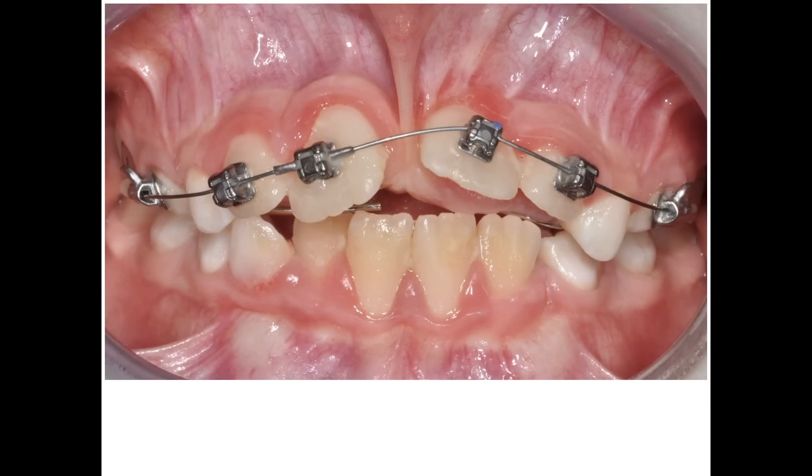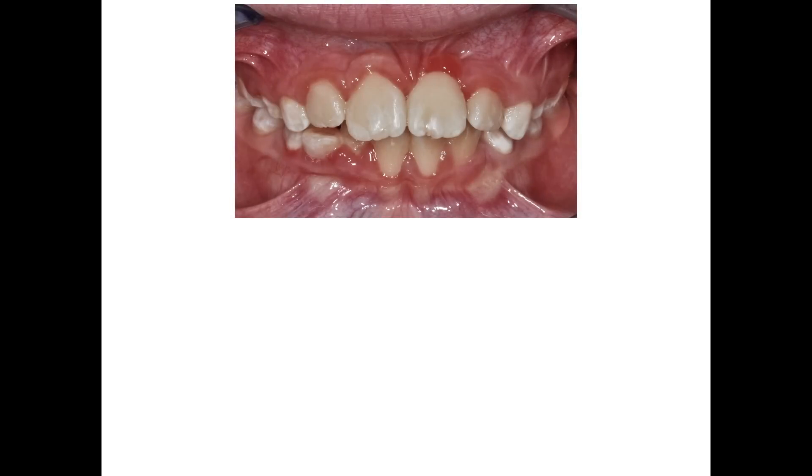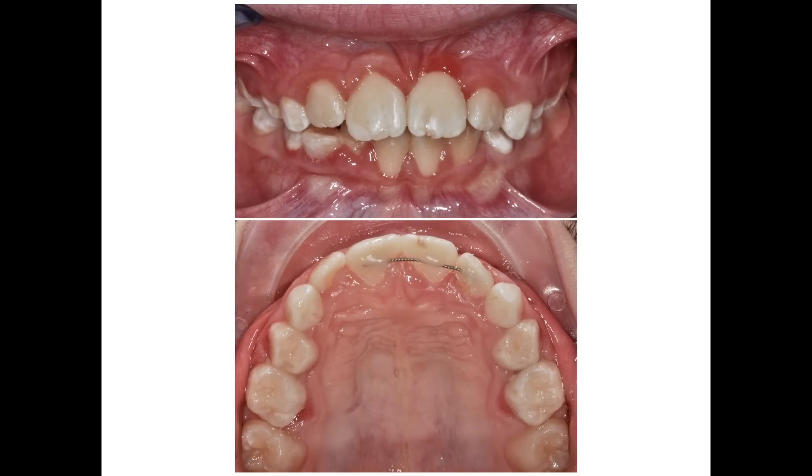As you can see, the teeth are moving towards the right position without major inconveniences, aside from some gingival inflammation. After six months of interceptive treatment, 21 is in the right position. The poor oral health of the patient did not help the newly formed gingiva to look great, but hopefully it will improve over time.